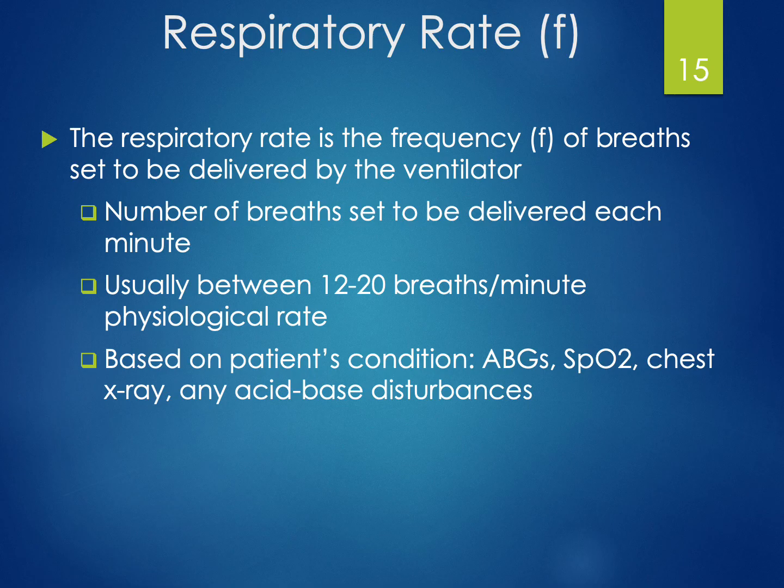So this is going to show up on the ventilator as maybe R or RR. It may say RESP rate. It could have just an F or FREQ. And that F, or FREQ, stands for frequency, or the frequency of breaths per minute.